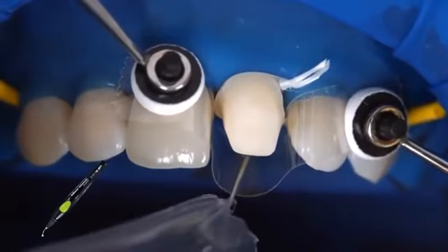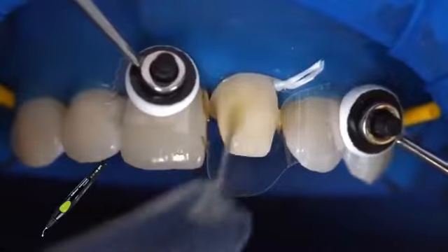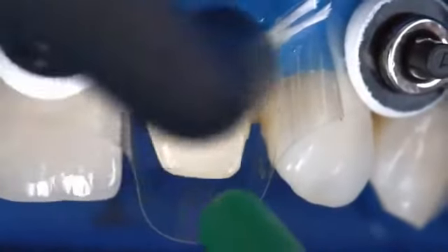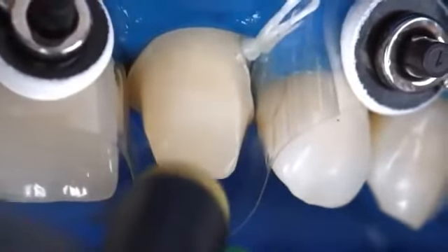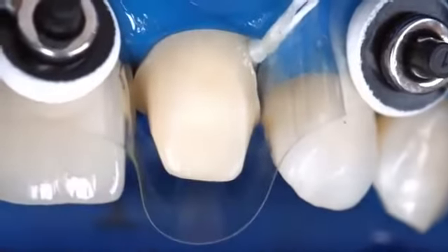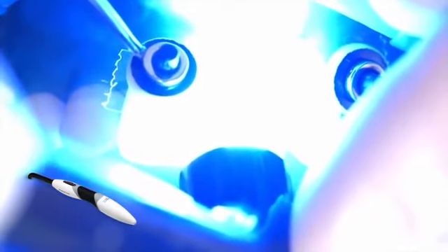Coat the entire bonding surface with Adhese Universal and scrub the adhesive in for 20 seconds. Disperse excess amounts of Adhese Universal with a stream of air until the mobile liquid film has disappeared. Make sure to avoid pooling. Light cure Adhese Universal for 10 seconds using a curing light with a light intensity of at least 500 milliwatts per square centimeter, for example Bluephase Style.